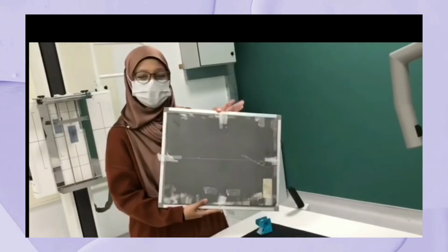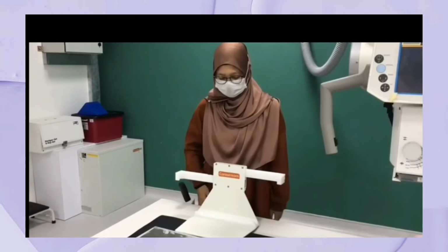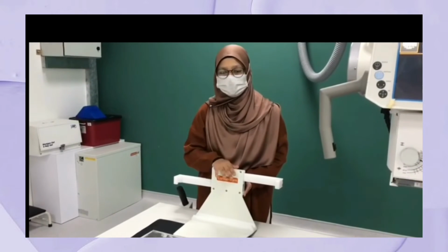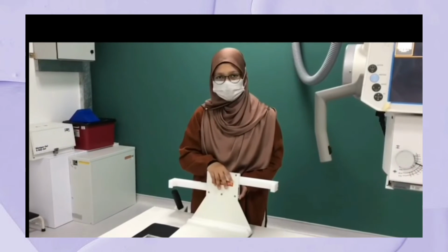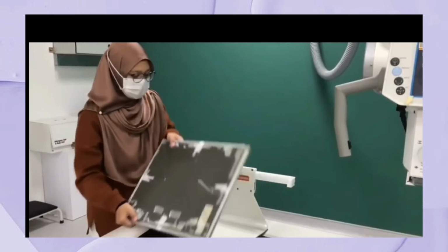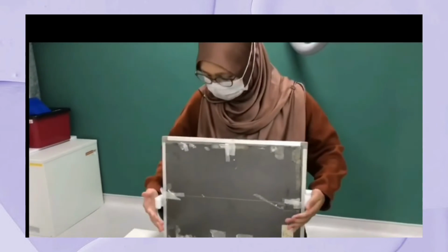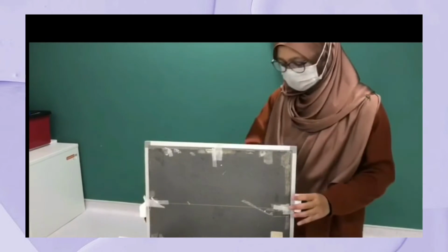So the grip will stay at the cassette. Okay. Next, this is the cassette holder if we do a horizontal projection. Okay. So we will put our cassette here, and then we will tighten it. Okay.